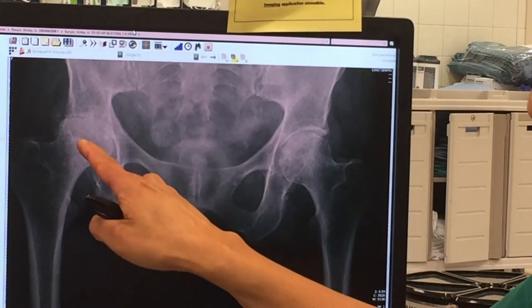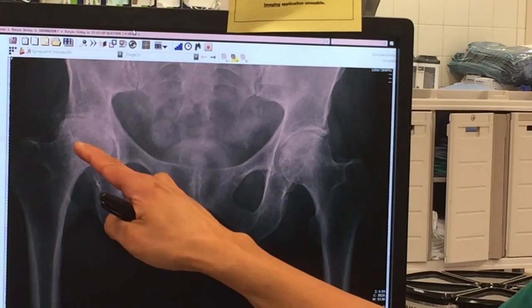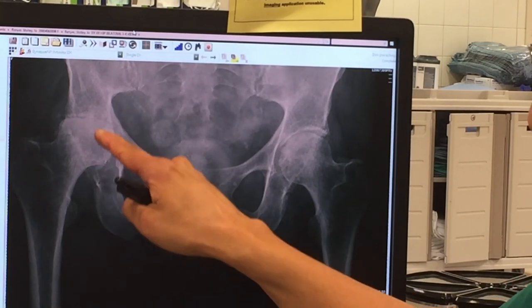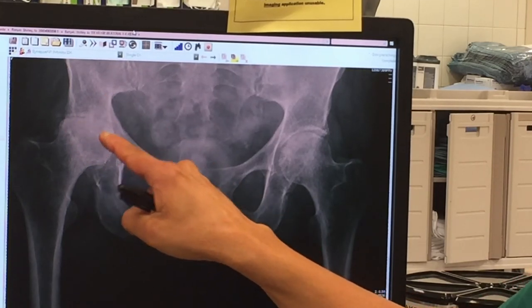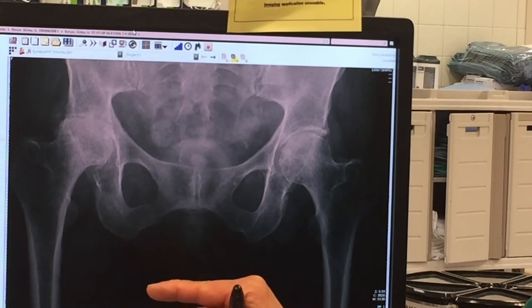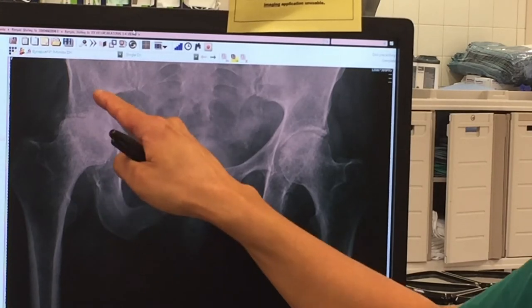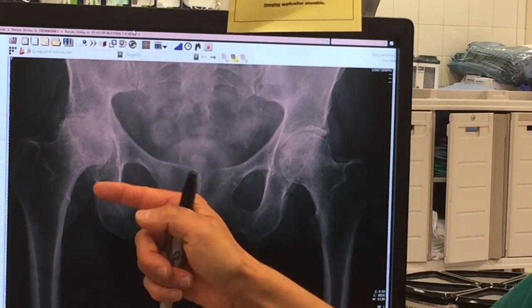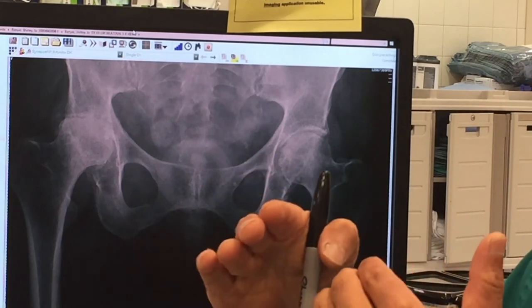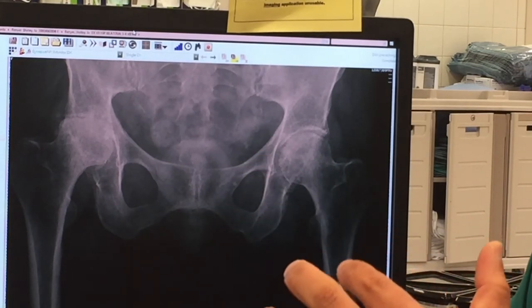An arthritic hip looks like this — very different. Structurally we see the ball and socket, but now there is no space between the bones. This is called bone on bone, because it looks like bone on bone. There is no intervening cartilage or cushion to protect those bones.